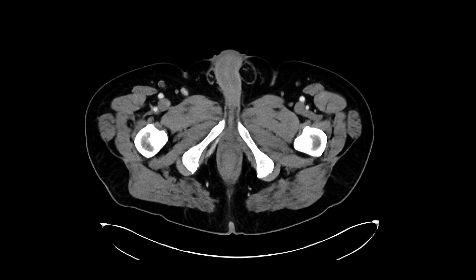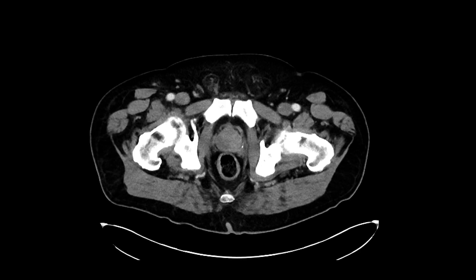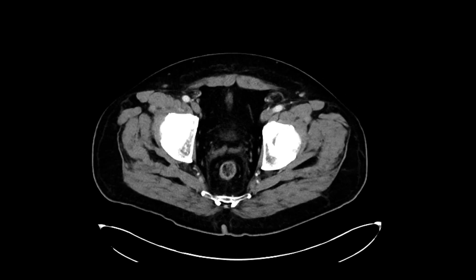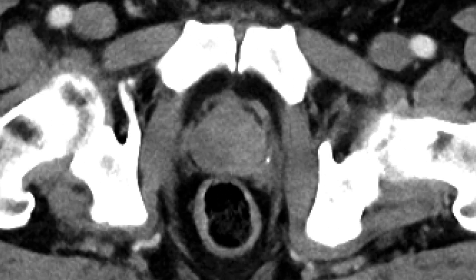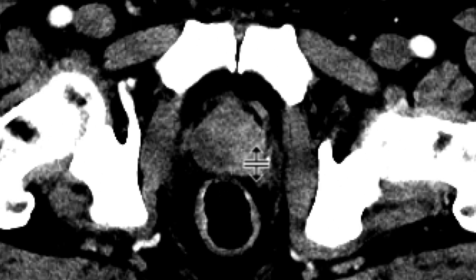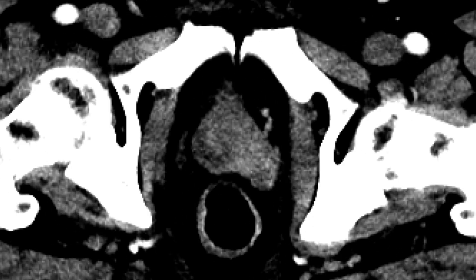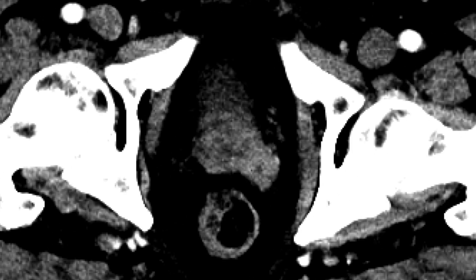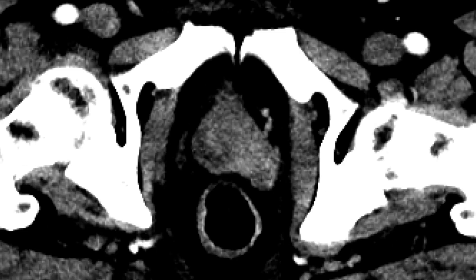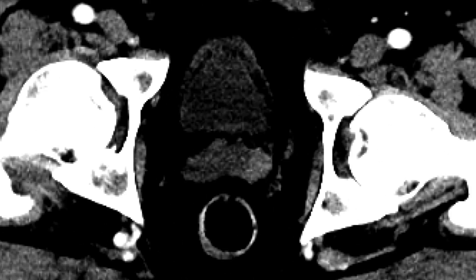But the reason I want to show this case is there's an incidental finding. If you go upwards and look at the prostate gland, we can see that the left peripheral zone, if we window it, looks a little bit more hyper-attenuating than the right peripheral zone — it almost looks mass-like in its appearance. And if you look at the left seminal vesicle, it looks a little bigger and more hyper-attenuating than the right seminal vesicle, which is within normal limits.